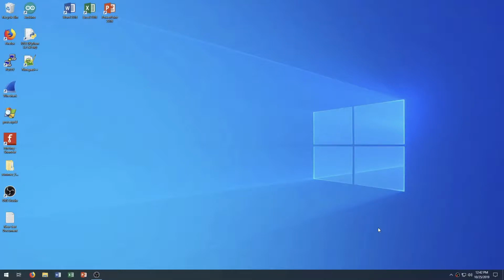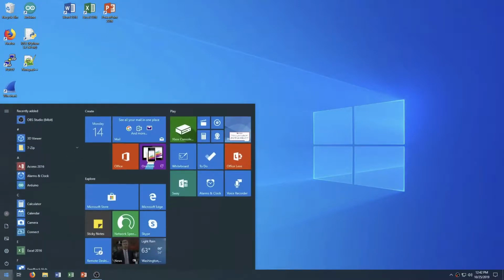Alright, so in this video I want to show you how to get the test data off of the analyzer unit and onto a computer in something that can be opened with Excel or Notepad or something like that.